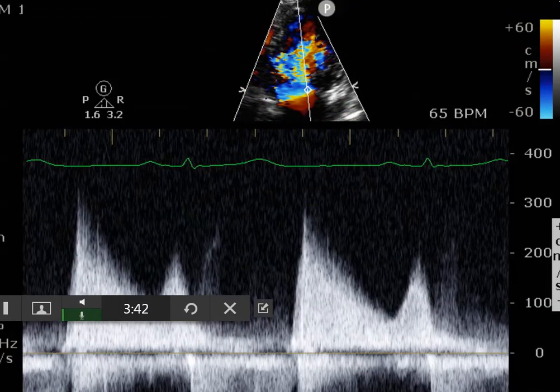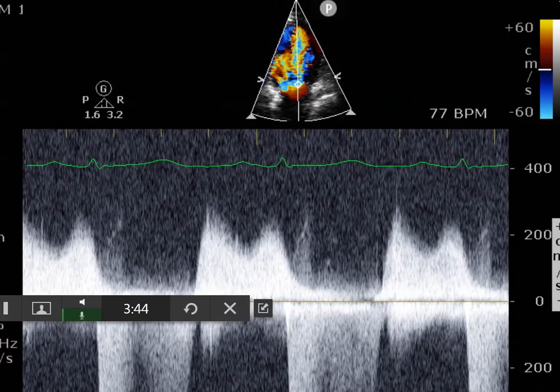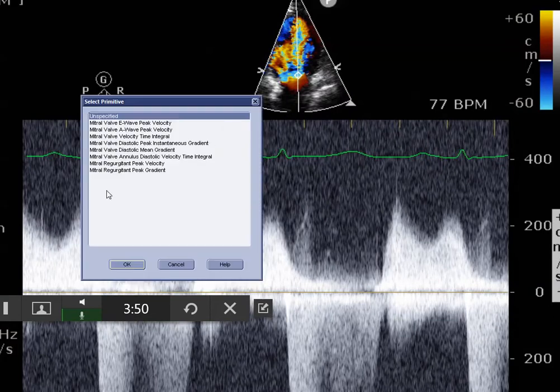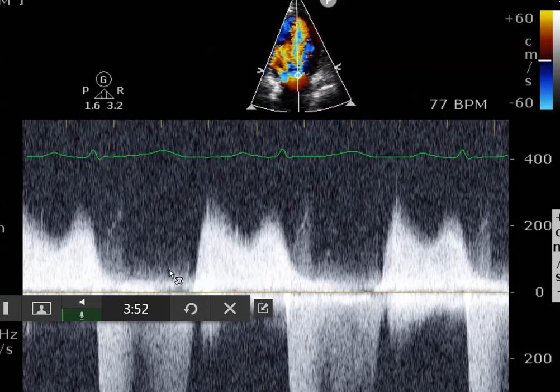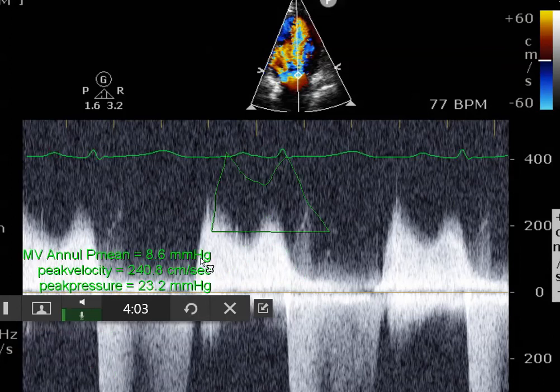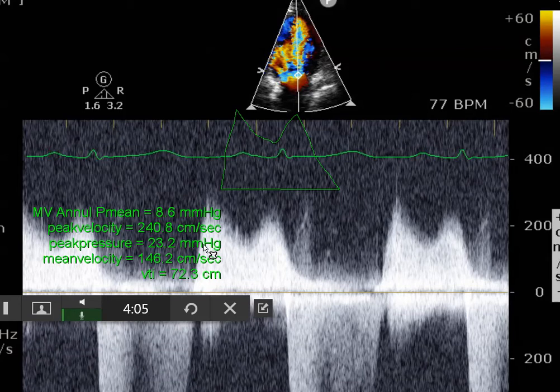I got a little bit higher numbers later on. So here, we'll try this one. Again, cutting out the hairier parts. Getting numbers of about 8.6. That would make it meet the criteria for severe mitral stenosis.